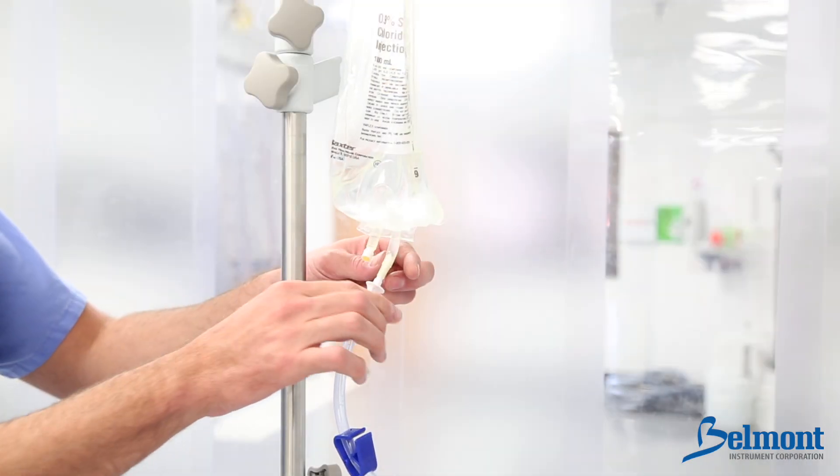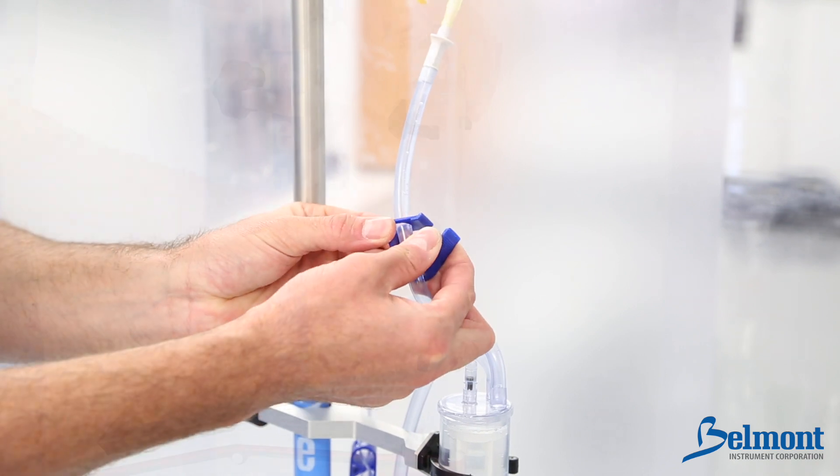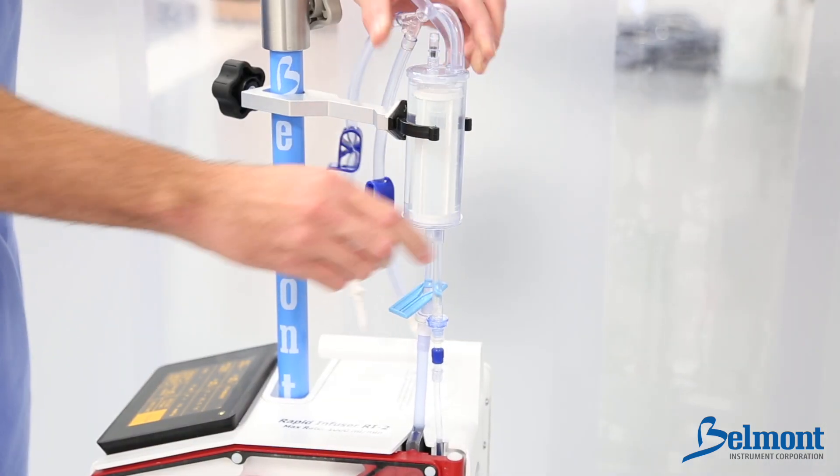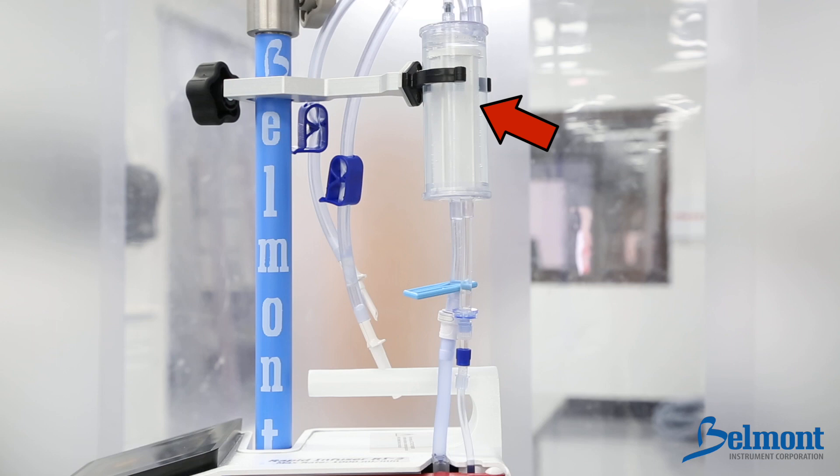If the fluid bags are not empty, check to make sure they are properly spiked, clamps are open, and the tubing is installed correctly. High amounts of particulates in the blood may clog the coarse blood filter in the reservoir chamber. Replace the reservoir chamber or disposable if it becomes clogged.